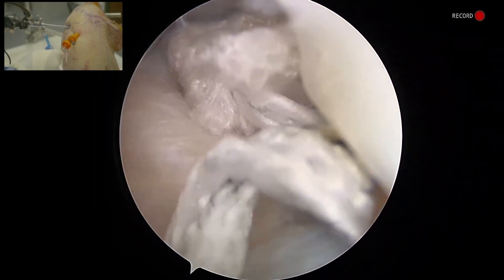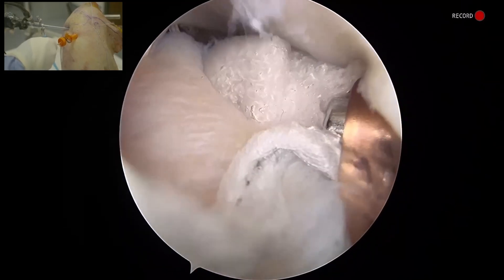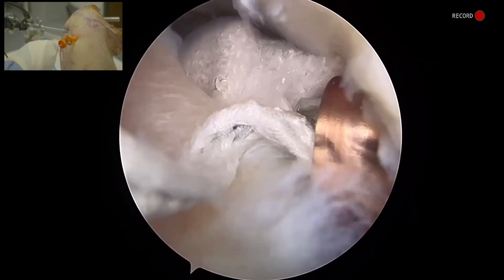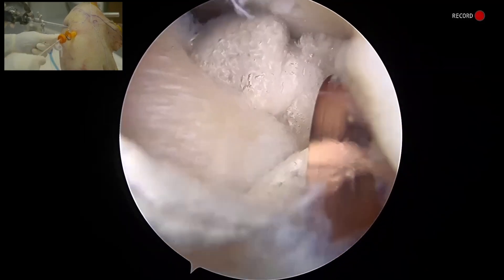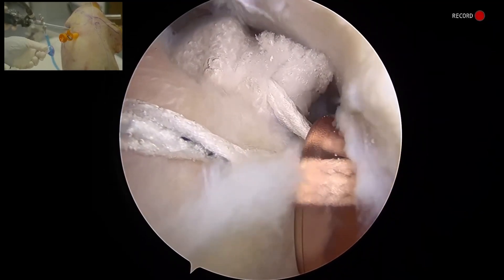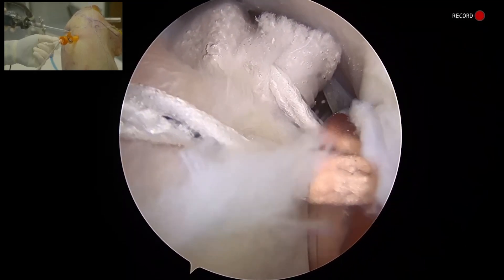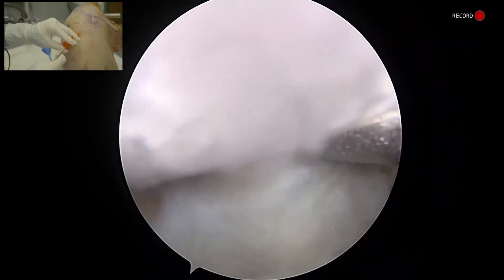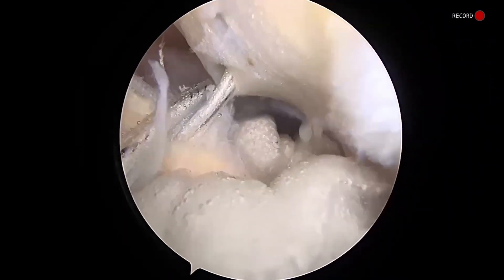Now we're going to shuttle one segment at a time. I like to use a knot pusher to shuttle these into the joint. You can also use a grasper to push the construct if you feel more comfortable. I've got my knot pusher seating this BioBrace segment into the subacromial space. It's a little bit bunched up, which I don't mind at all — as I place my lower row anchor, that will open up and lay nice and flat. Two BioBrace strands are now seated over our cuff.